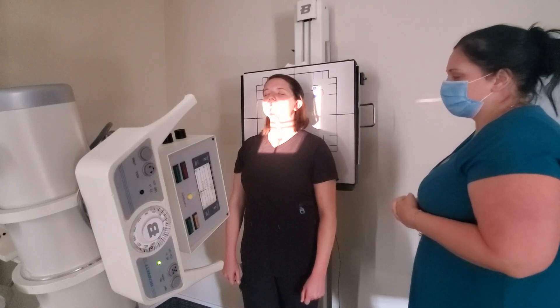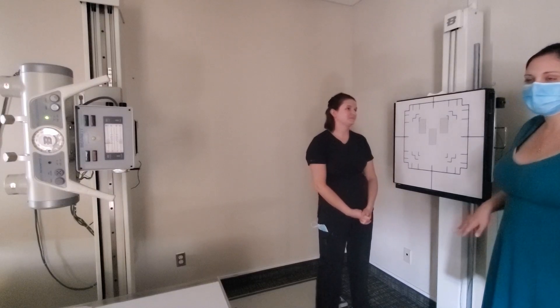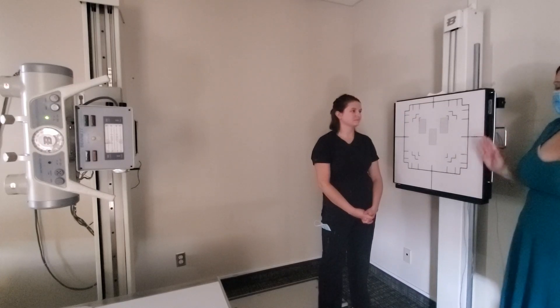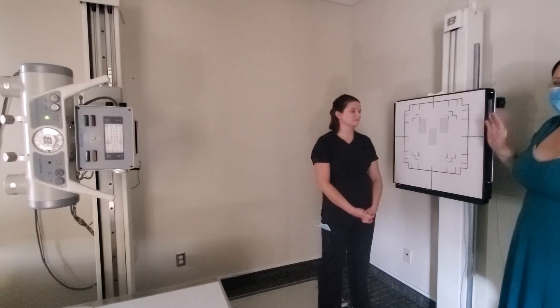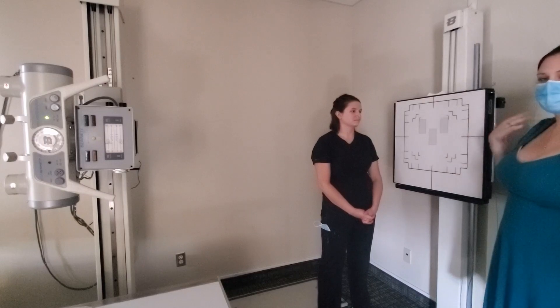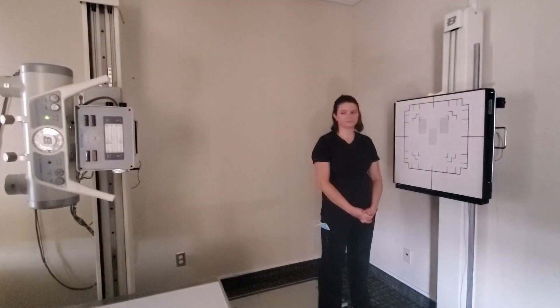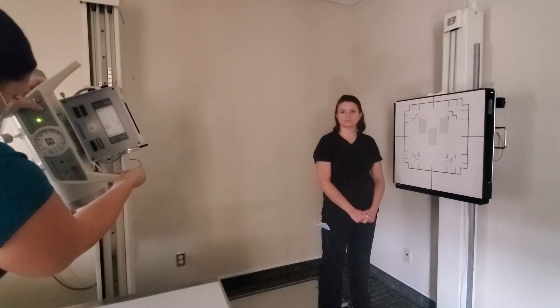For the AP oblique C-spine, this is one that students sometimes struggle with because of the distance change. Anytime you're working with the C-spine in true AP position you're at 40 inches, but the second you start rotating that patient you need to go to 72 inches because of magnification between the shoulder and the spine. At 72 inches, AP oblique uses a 15 to 20 degree cephalic angle, just like AP axial.